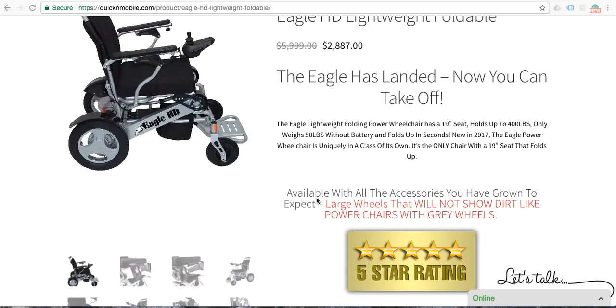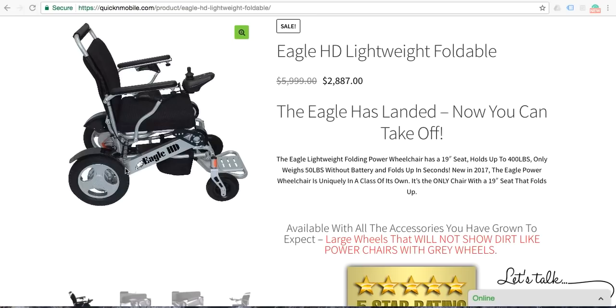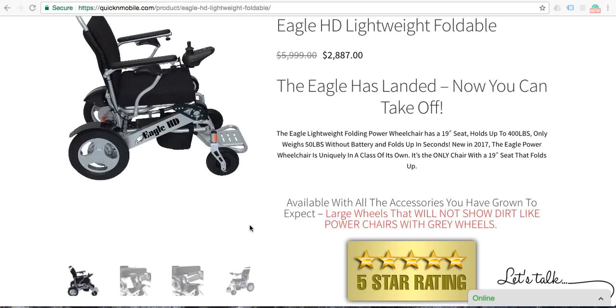Additionally, the Eagle is available with all of the accessories that you have grown to expect with a power folding wheelchair. You do not get nickel and dimed at the end when it's time to check out. It does have large wheels and you will notice that the wheels are black polyurethane blend, they are not gray. Gray wheels on folding power wheelchairs will show every last trace of dirt within about a week. In our opinion, there is nothing worse than getting a brand new product and having it look dirty and dingy in less than a week's period of time. That will not happen with the Eagle Folding Power Wheelchair.